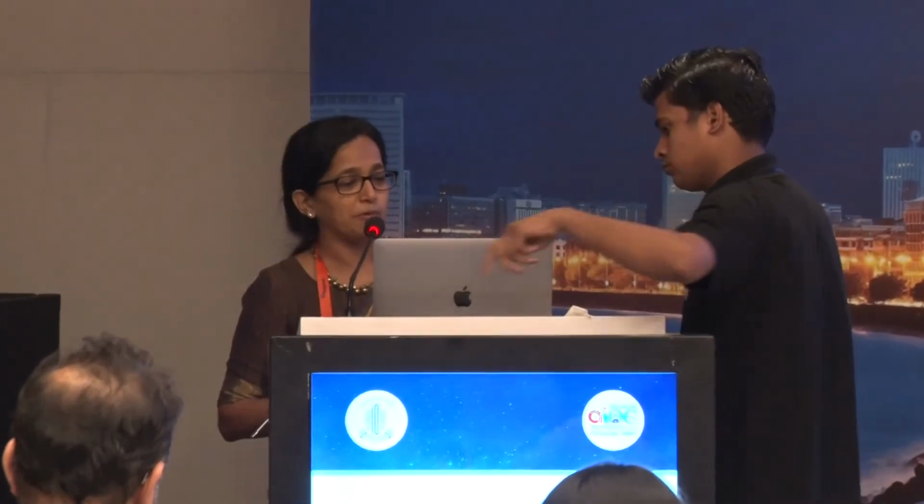Thank you, Dr. Nagvekar, sir, to have me here. So I'll be talking about supporting a sagging lens. So basically talking about zonular dialysis.